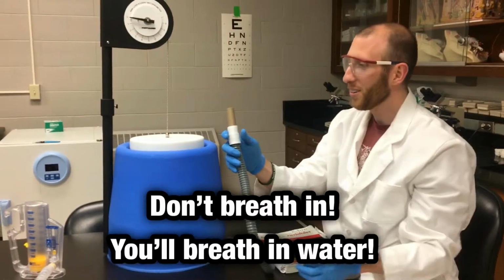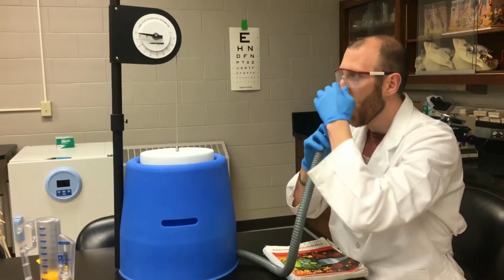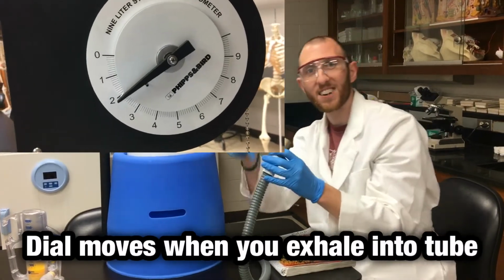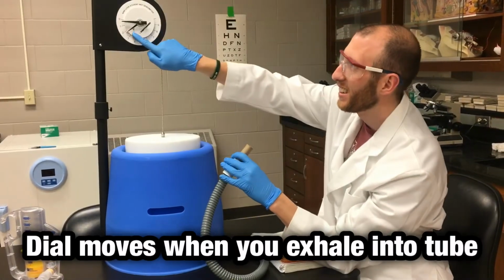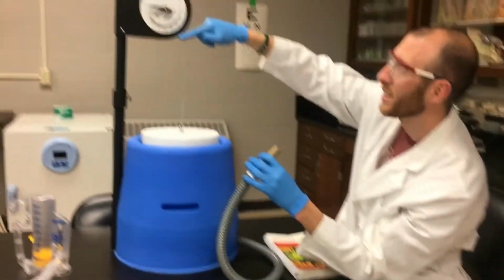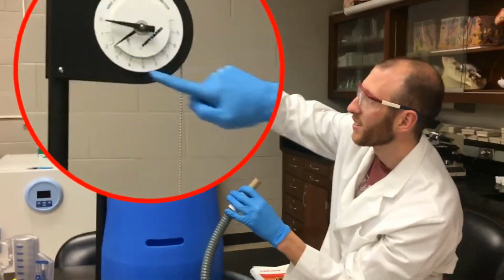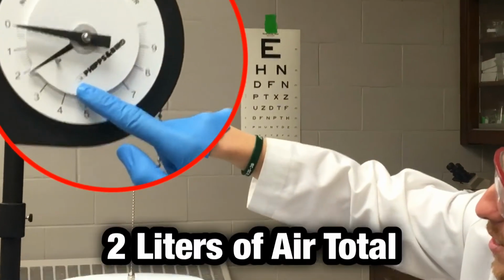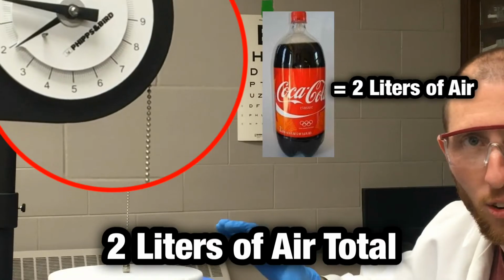So for example, if I go, that was me exhaling into the tube, and as you can see, if you zoom up here, it showed me how many liters of air I just exhaled, and it was about 2 liters total.